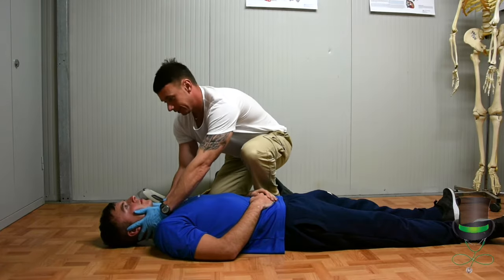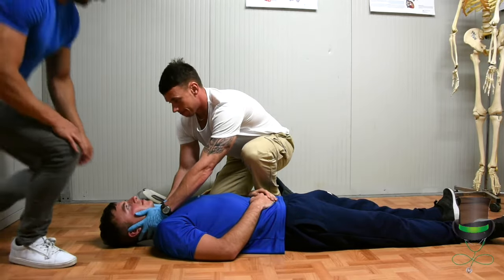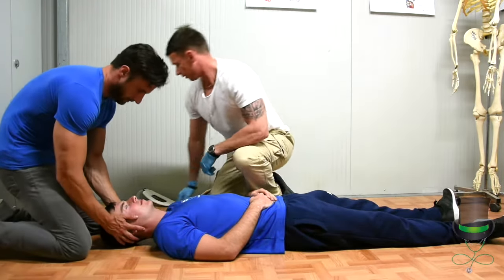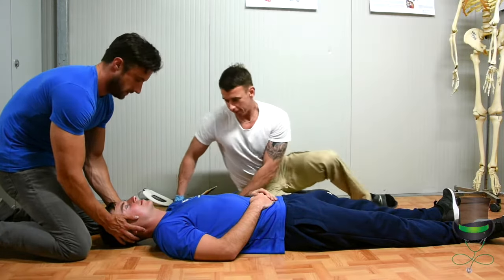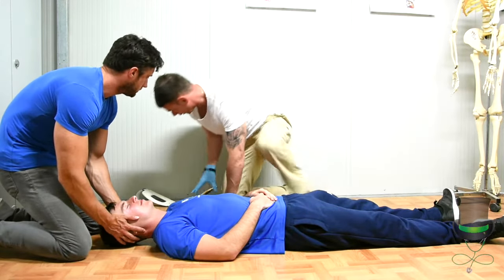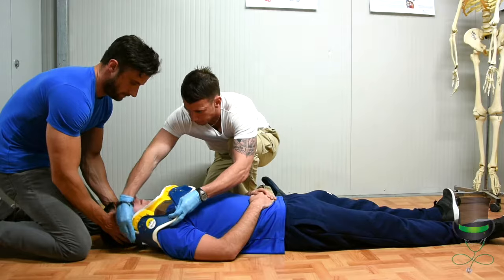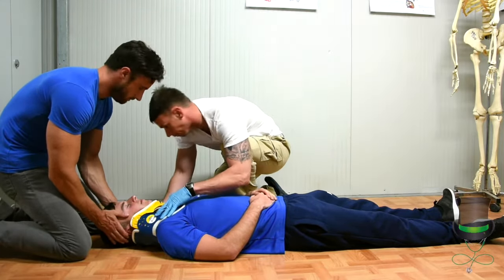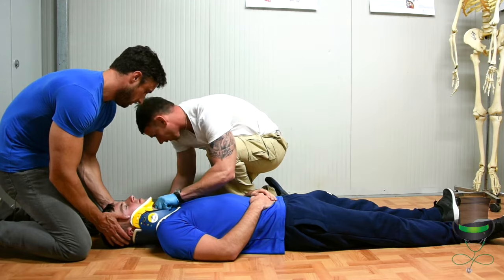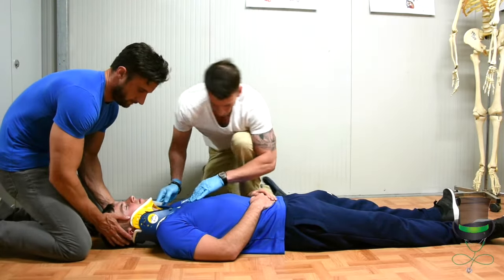Ensuring C-spine immobilization is in place, I would then direct my assistant to take over C-spine. I would then size a collar, form it, and place it on the patient. This collar is going on as an added safety measure. Make sure the collar is centralized.